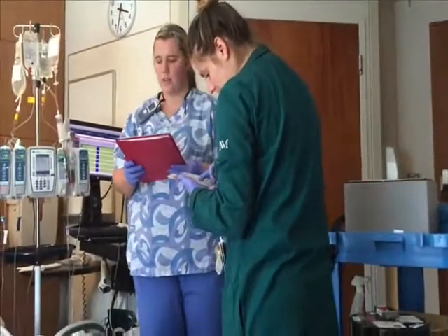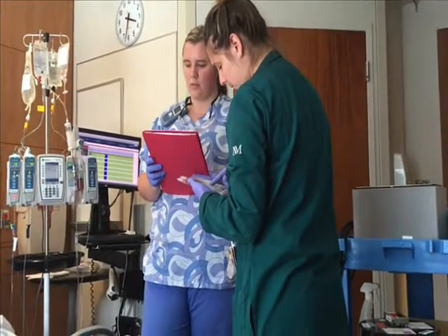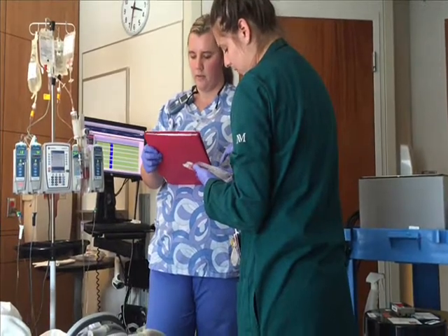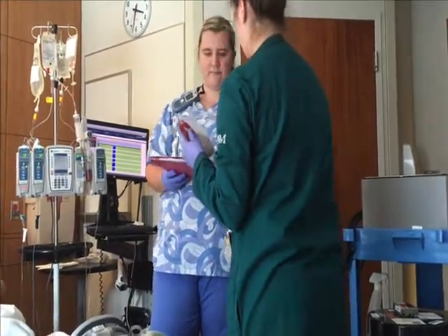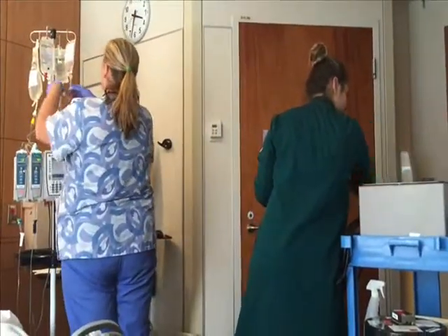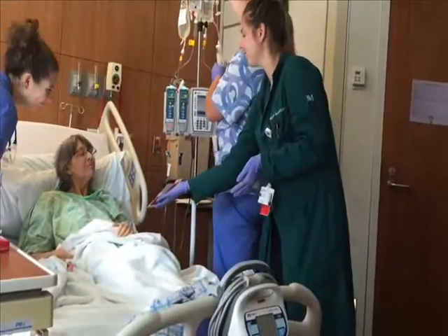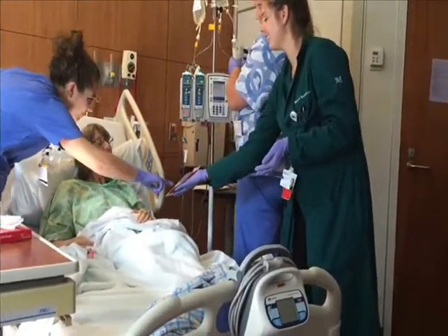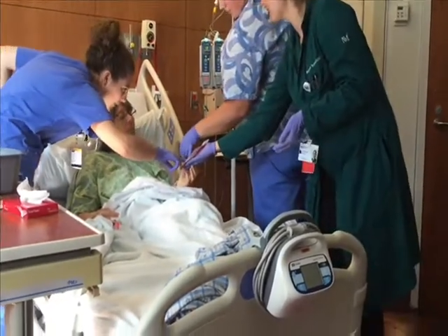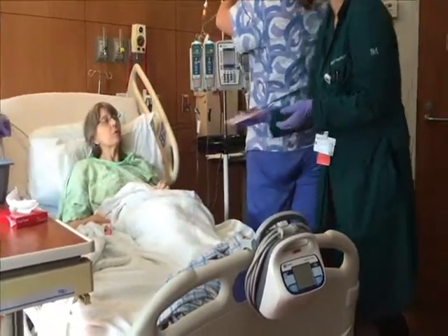I have Cynthia Spritzmeyer, 700-898-647, donor pool 17598. Bag 2 of 3, patient is B positive, donor is B positive. One last check. Cindy needs to look at the bag. See your name on there? It's smaller. It's Brenda. It's right there. Oh, her name is on it. Yeah.